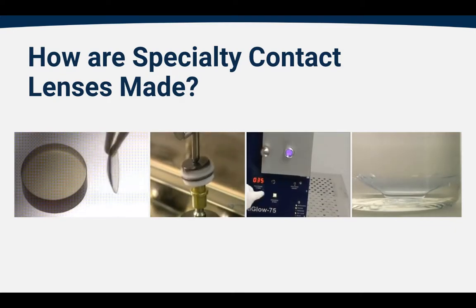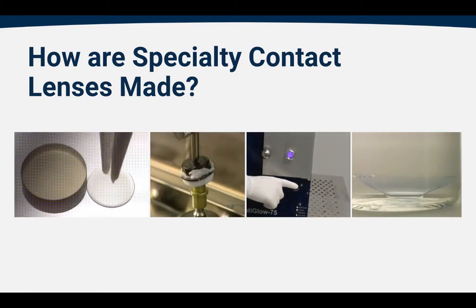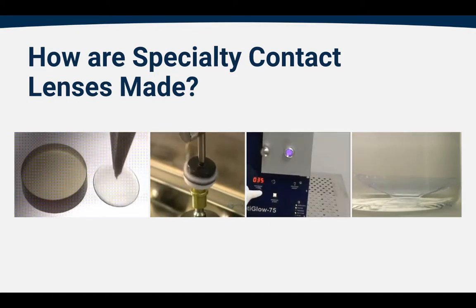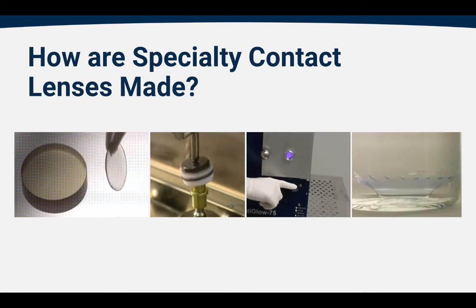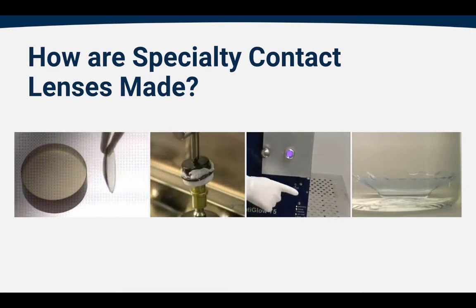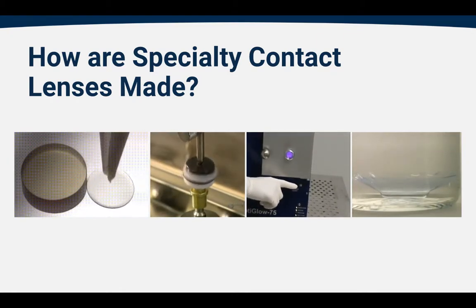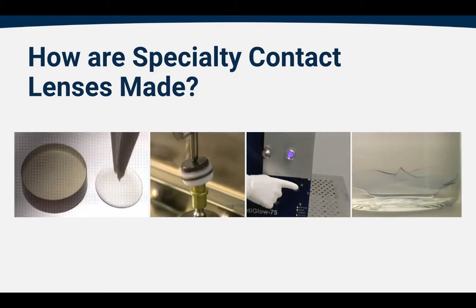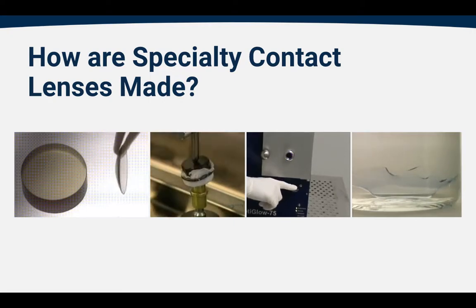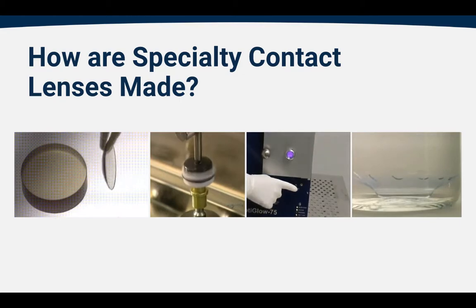And the plasma treatment process uses plasma state oxygen to clean the lens surfaces. And what this does is it also creates a hydrophilic surface so that water coats the front surface of the lens rather than beads on the front surface of the lens, so that the optical properties are even more perfect when on the eye. If the lens is a soft lens, it undergoes the hydration process like what you're seeing on the right hand side.